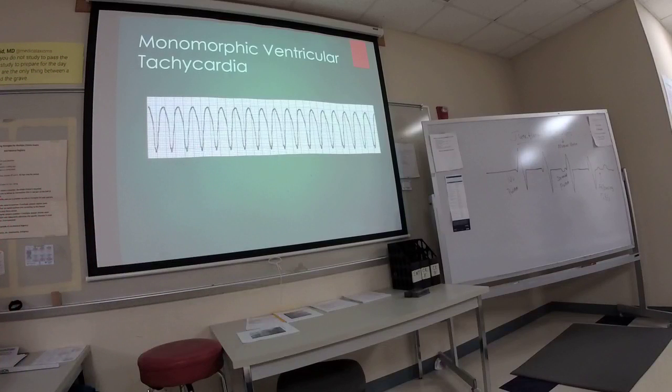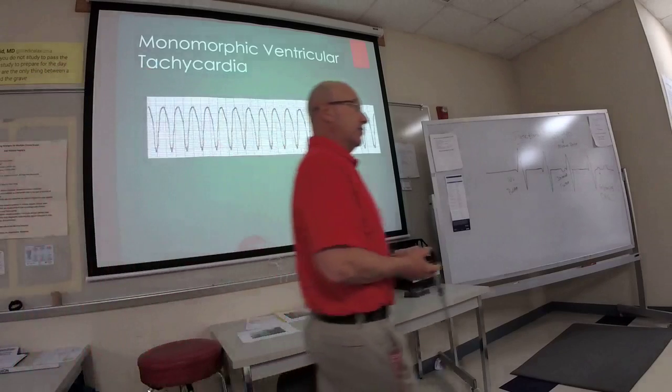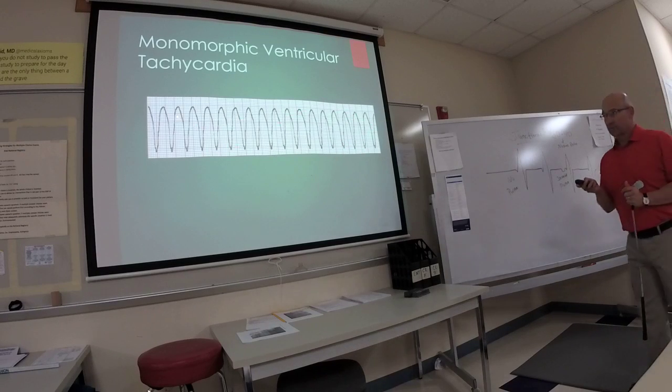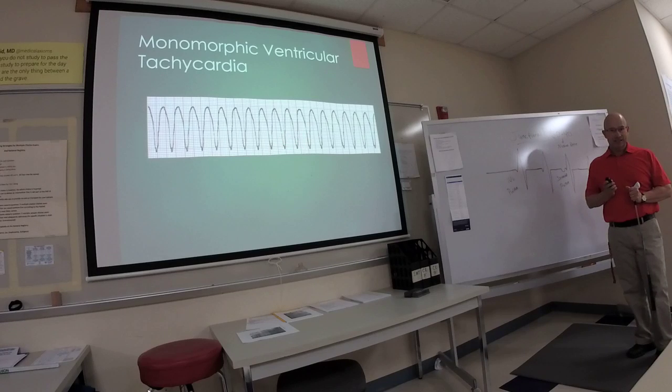Without a pulse, you would defibrillate it. It's one of the two shockable rhythms. What's the other shockable rhythm? V-fib, right. So V-tac without a pulse, lethal. It's shockable, right? V-tac with the pulse, it's going to be lethal if you don't fix it.